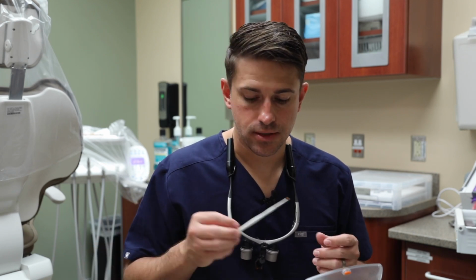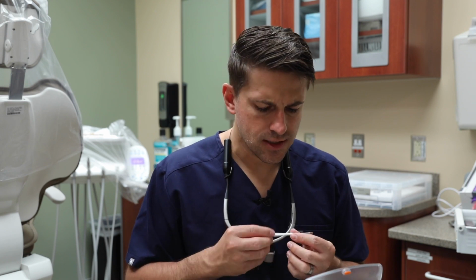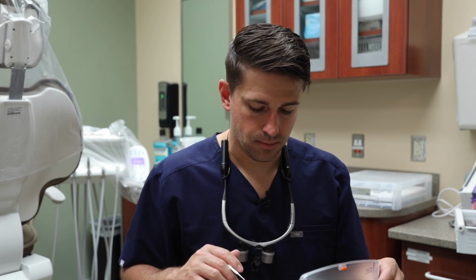Again, for brushes, something small. To apply the glaze, I prefer to use a 00, or a 0 would be a good one as well. You don't want a huge brush because if the brush is big, you're going to be slapping this glaze all over the place, and it's going to be a lot harder to control, putting it on in a nice even way. Especially if you've got some nooks and crannies you're trying to get the glaze into. I prefer a small brush personally. That's just my personal preference.